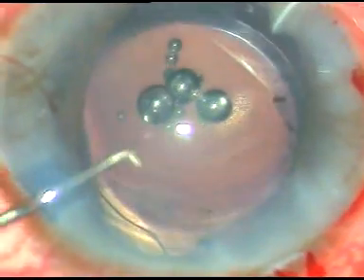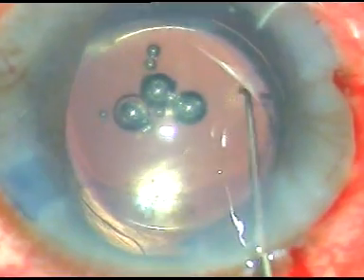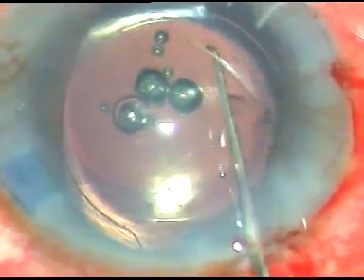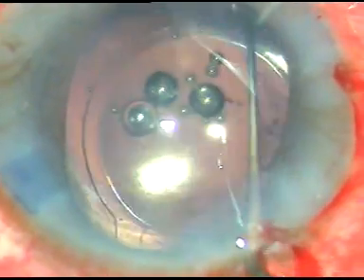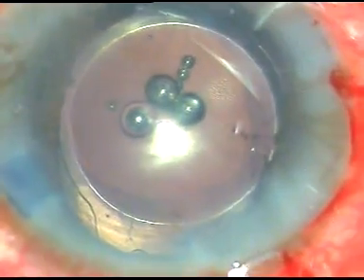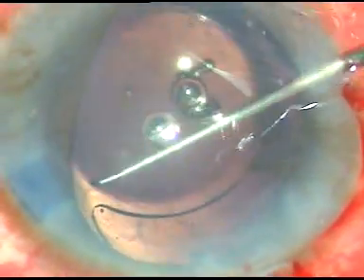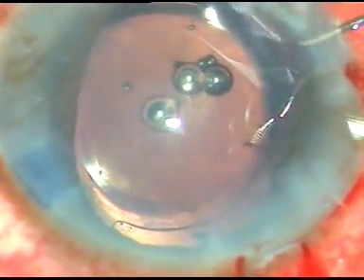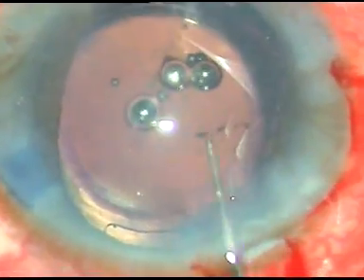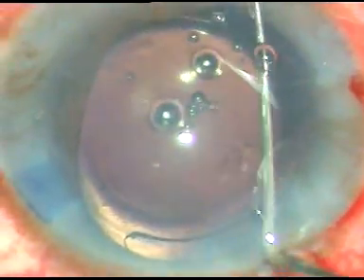Now I want to dial the lens so that I can go behind the lens and remove the viscoelastic substance from the capsular bag. This is how I dial the lens. There is a gap in the haptic. I go to that gap and dial the lens. Now the lens is in such a position that I will be able to go behind the lens. Now see what I am doing.